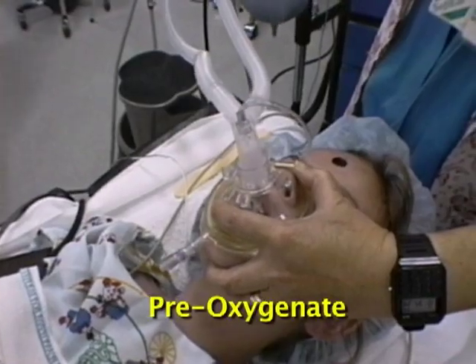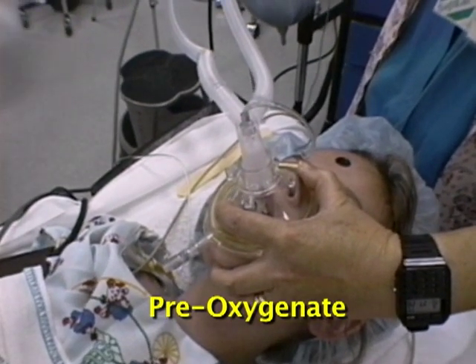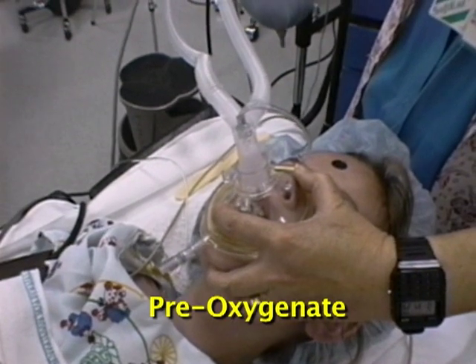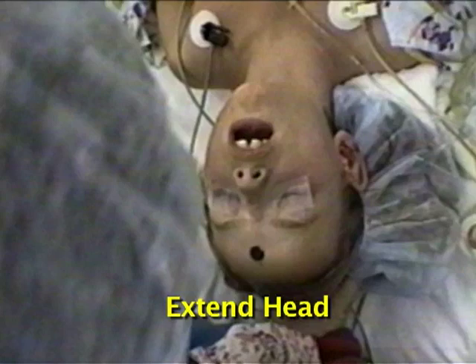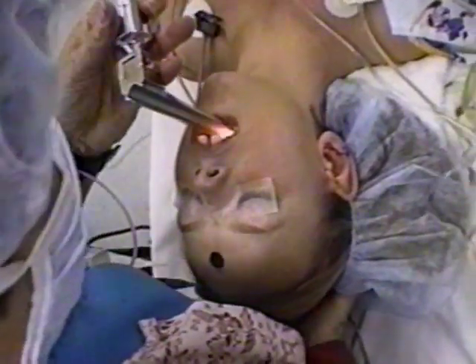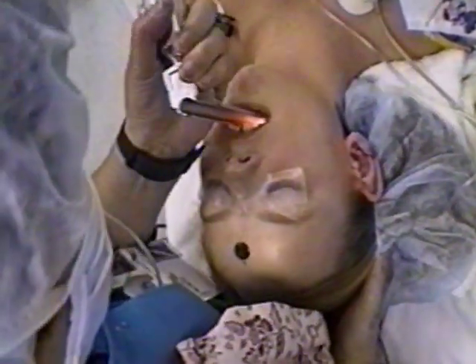Oxygenate the patient well before starting. Intubation is accomplished in a smooth, coordinated sequence of alternating hand motions. To intubate, extend the head but avoid hyperextension, which can obstruct the pediatric airway. Lift the blade with your left hand with the blade facing away from you.